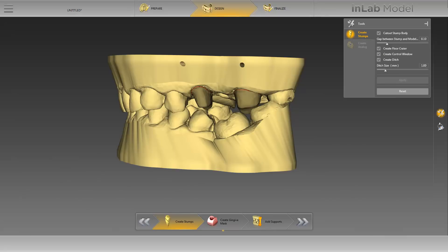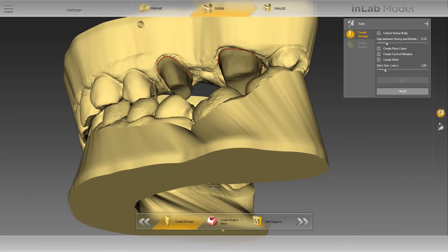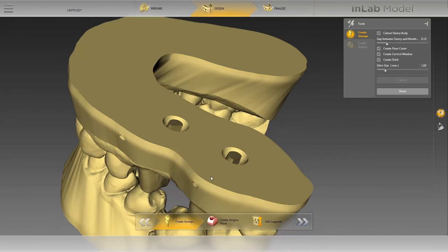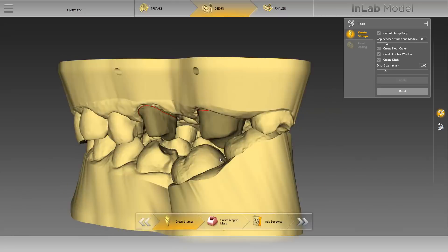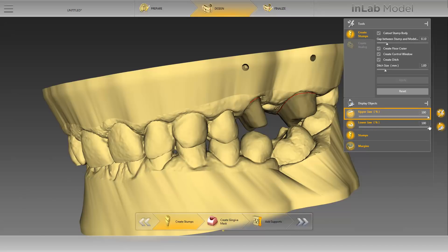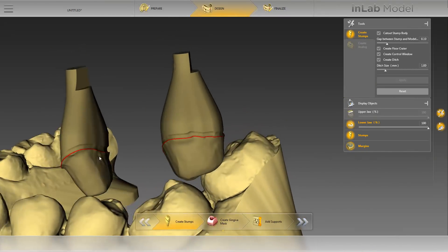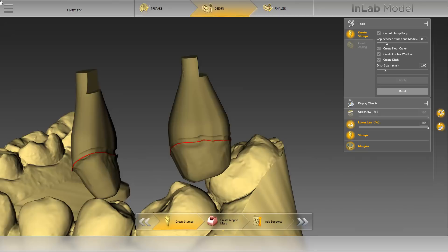Once the calculation of the stumps has finished, they will be displayed in a slightly darker shade in the 3D model. For demonstration reasons, we will check the model and all settings made previously. In the upper jaw, the cavity for the stumps is clearly visible. In the vestibular view, you can see the control window. In order to look at the stumps, we select the Display Objects option in the Page Palette and deactivate the upper jaw. In this view, the crater for the stumps is clearly visible.